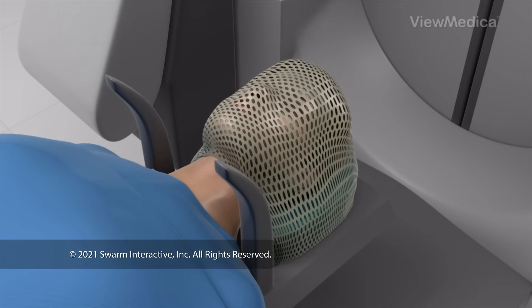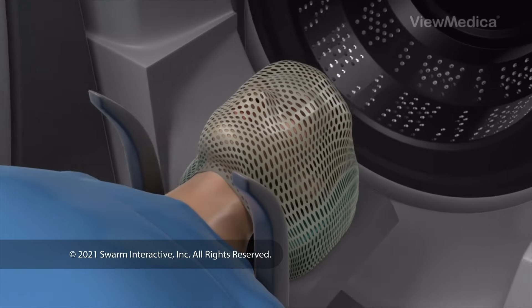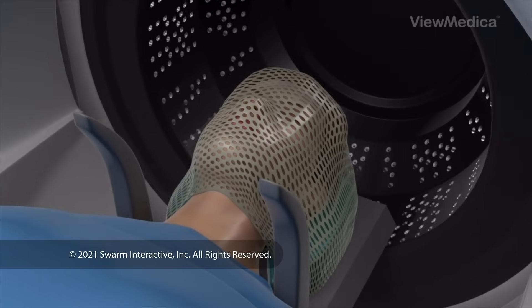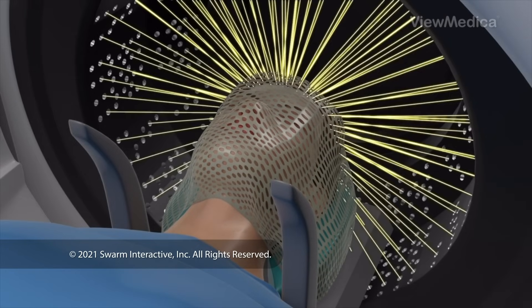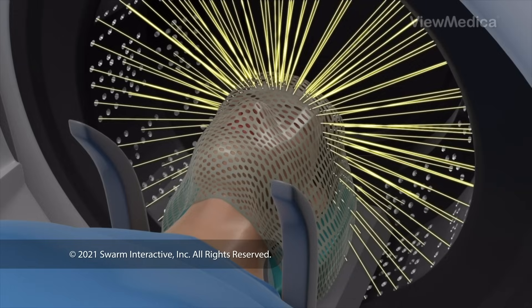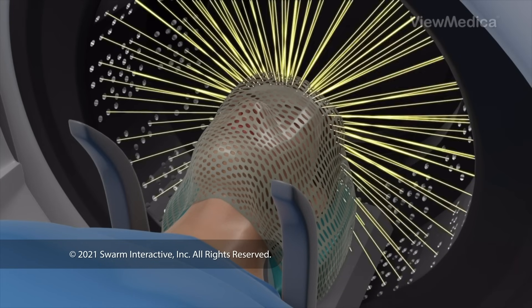Now you lie down and your head goes into the radiosurgery machine. There are a few types of machines, but they work in similar ways. The machine sends beams of radiation into your brain. There are several beams, and they come from different angles.